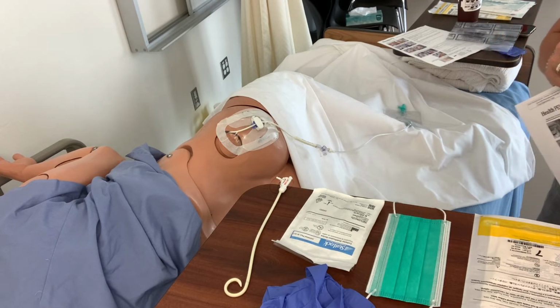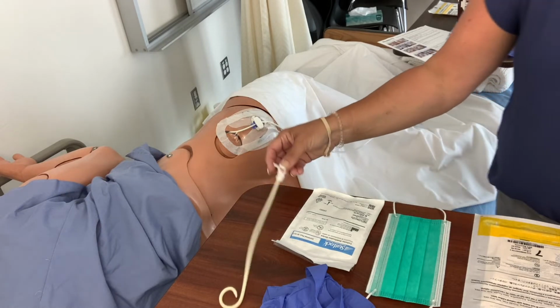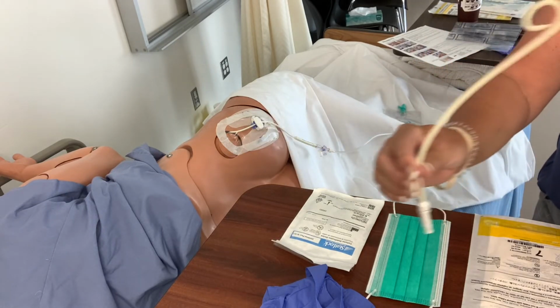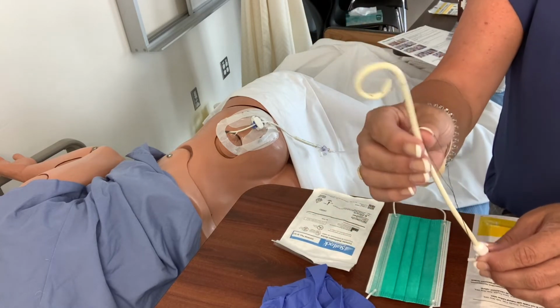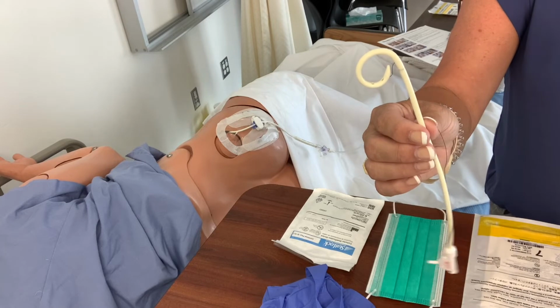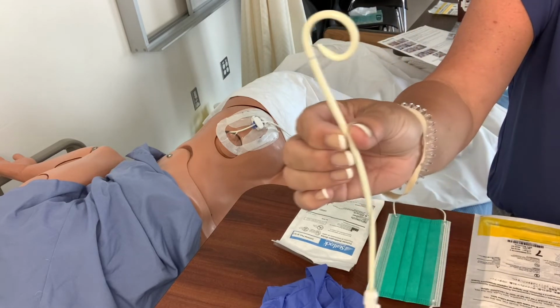Before we change the dressing, I want to walk you through some pieces and parts of equipment that I would have needed to gather before I started. Obviously I don't need to gather this. This is a pigtail because it's already inserted in the patient, but it's a good opportunity for you to see it. I call it a pigtail, others call it a pigtail, some call it a percutaneous drain. There's lots of things we may call this.